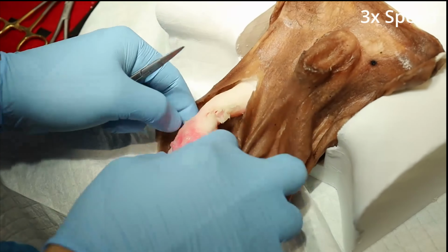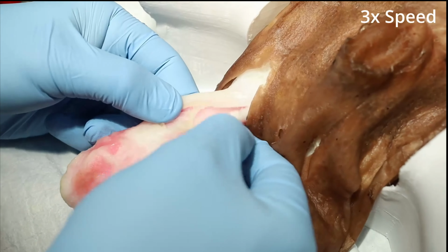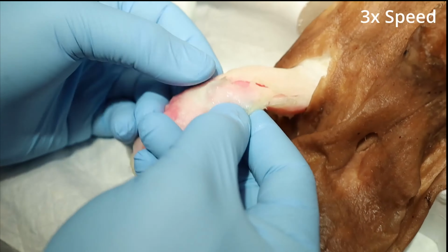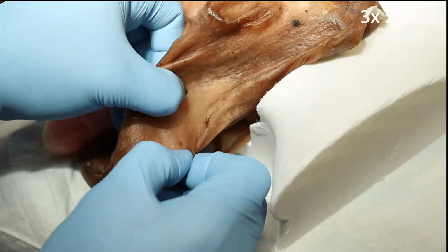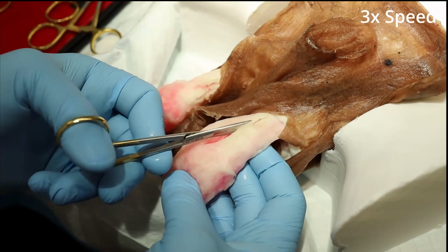An additional benefit that comes from the synthetic nature of this model is the ability to perform post-procedural dissections and evaluations. Here, surgeons are able to cut down the model in an educational setting in order to evaluate their performance, identify any errors, and ultimately improve their surgical techniques.